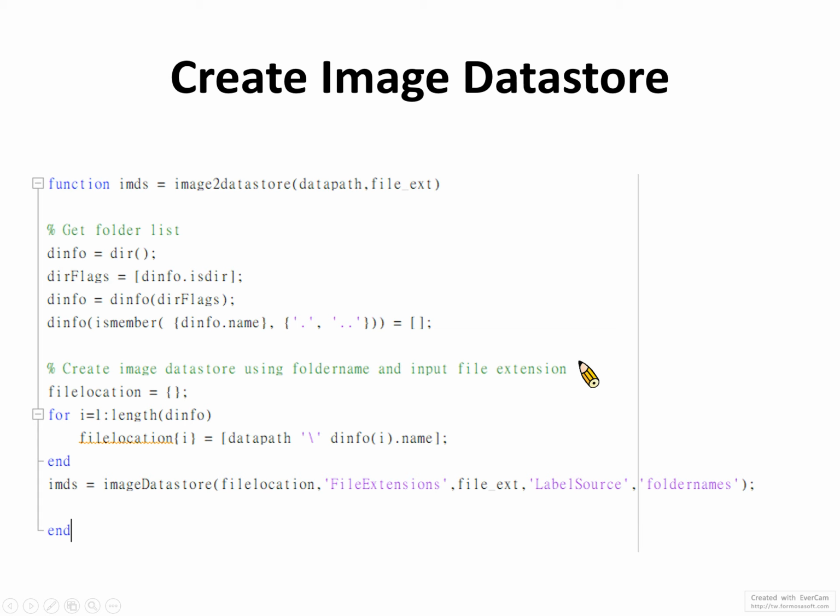If you remember in that course, the first step was to load the image datastore variables, which is the default database in MATLAB. But for this data, we need to create an image datastore to allow MATLAB to process it and to be further trained by the CNN models.